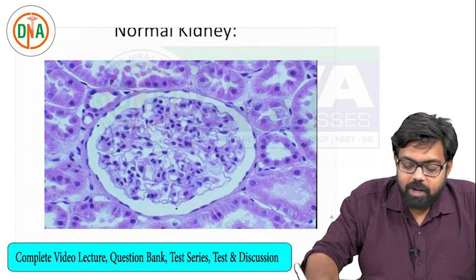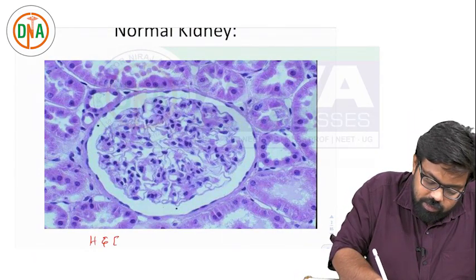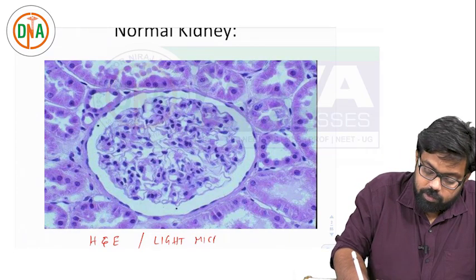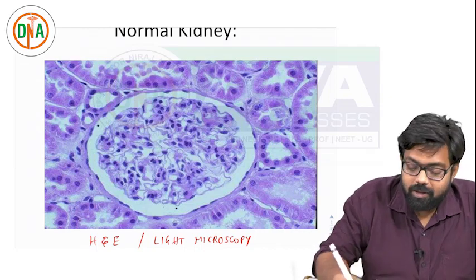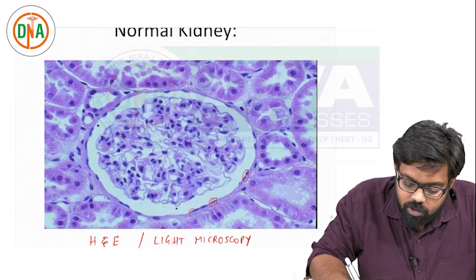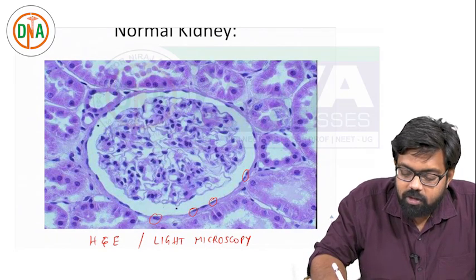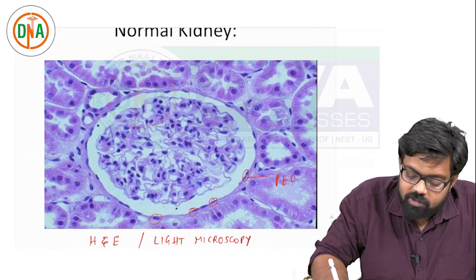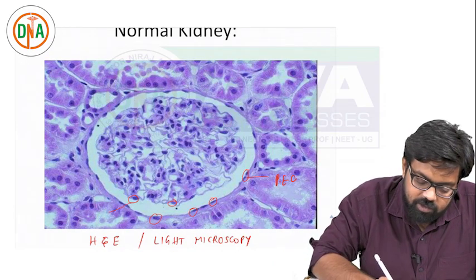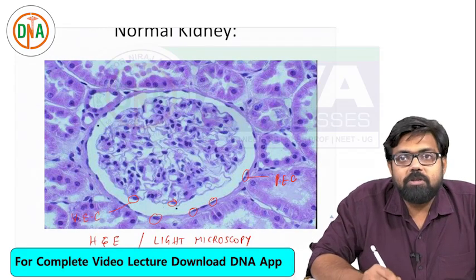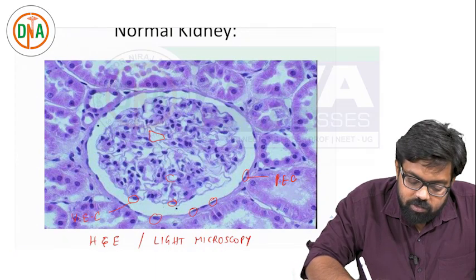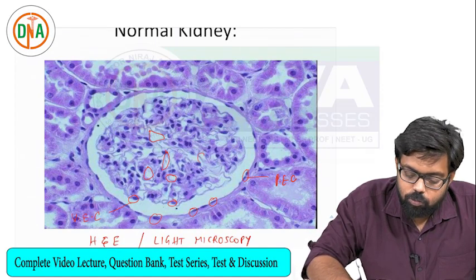What you are looking at is a normal H&E on light microscopy. This is a normal kidney. These are the parietal epithelial cells - these are the nuclei of the parietal epithelial cells. This is the nucleus of the visceral epithelial cells. The foot processes are not visible on light microscopy. And these are the glomerular capillary lumens.